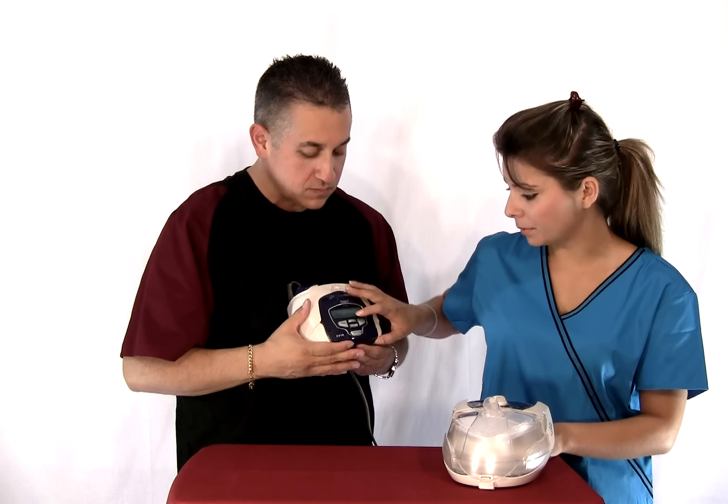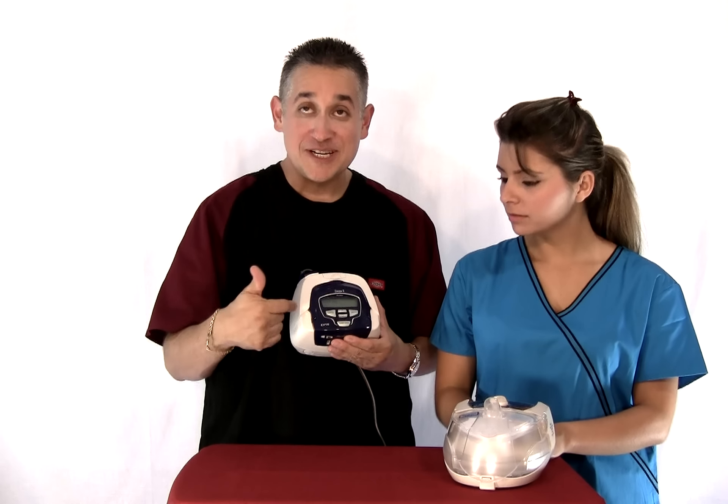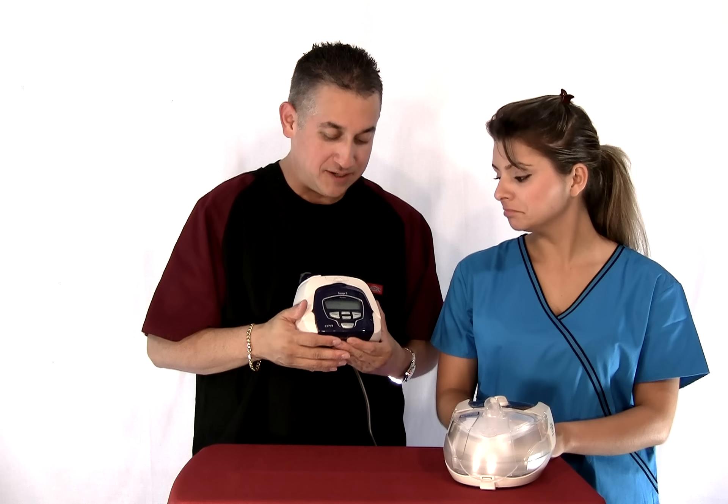While the machine is on, if you press any button — nothing happens. While the machine is running, you can press any of the buttons except start and stop and it will actually do nothing. So that's just the setting.